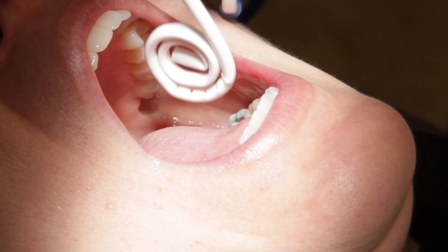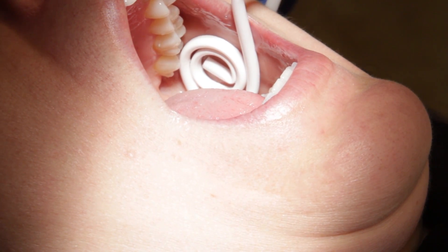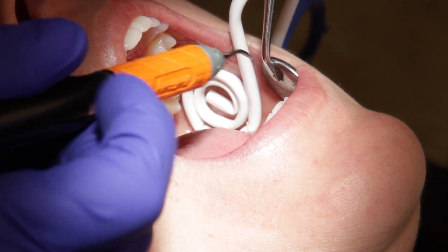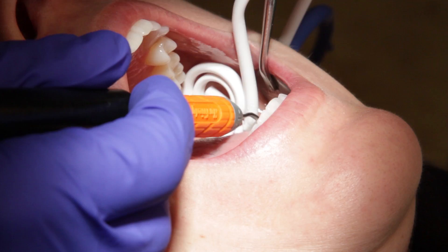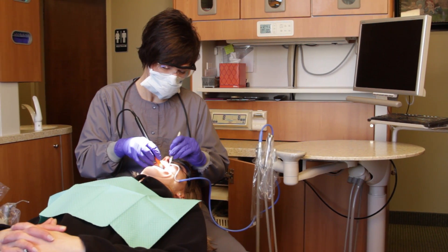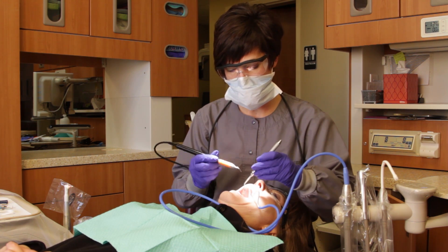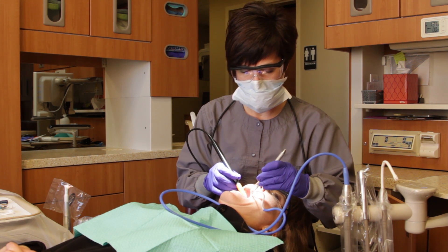To begin, place the saliva ejector between the molar and the cheek. Once in place, you won't have to hold the ejector to maintain its positioning, making both hands available for using a mirror and handpiece instrumentation. Because the BlueBoa tubing is so lightweight, it will not get displaced or fall out.